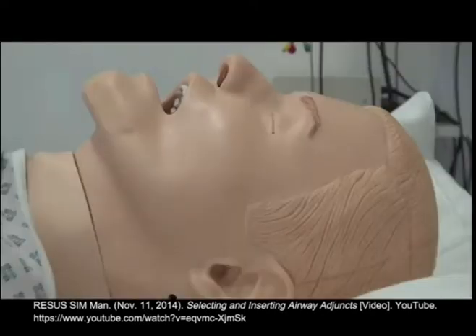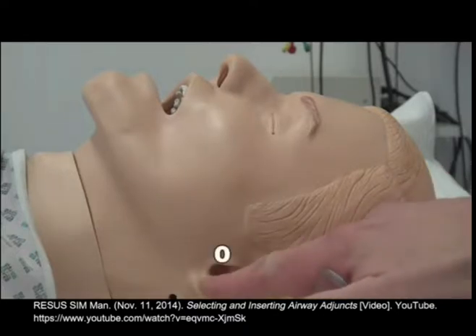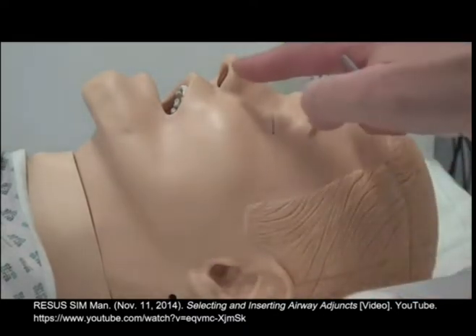In patients who do not tolerate an oropharyngeal airway, or in those who you are unable to use one, you may wish to consider a nasopharyngeal airway instead. Make sure you have the correct size nasopharyngeal airway before you try to insert it. A correctly sized nasopharyngeal airway will fit nicely between the tragus of the patient's ear and the tip of their nose.